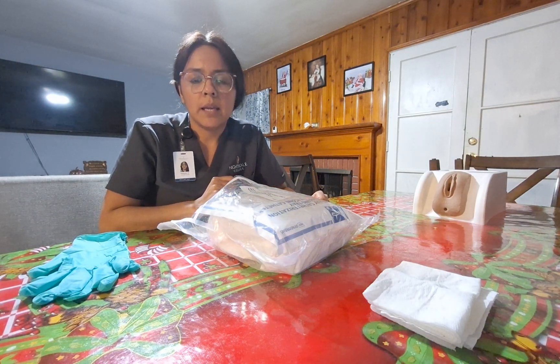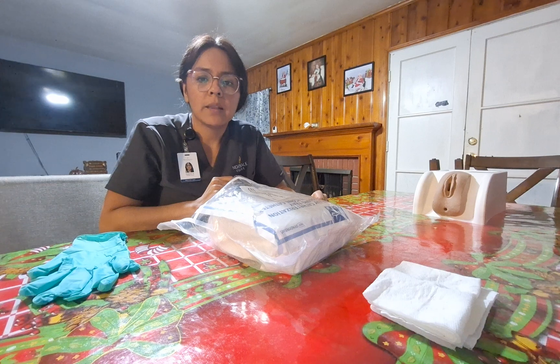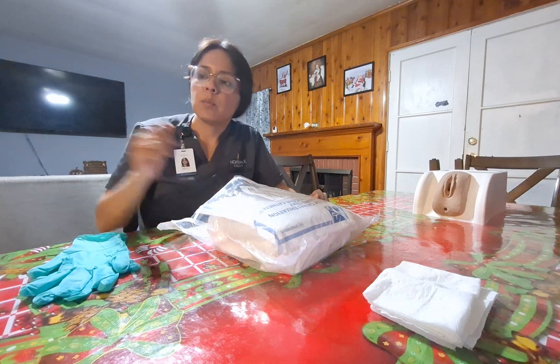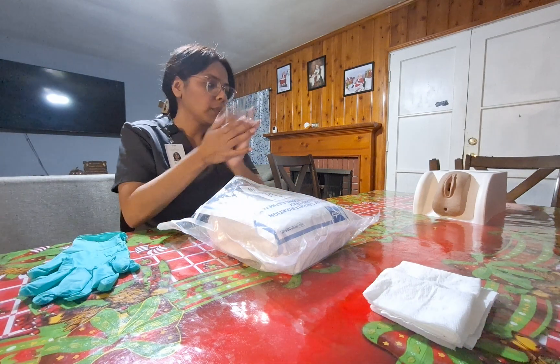Hello, my name is Stephanie and today I will be performing the female catheter insertion skills video. I've entered my patient's room. I close the door behind me to ensure patient privacy. I will perform hand hygiene.